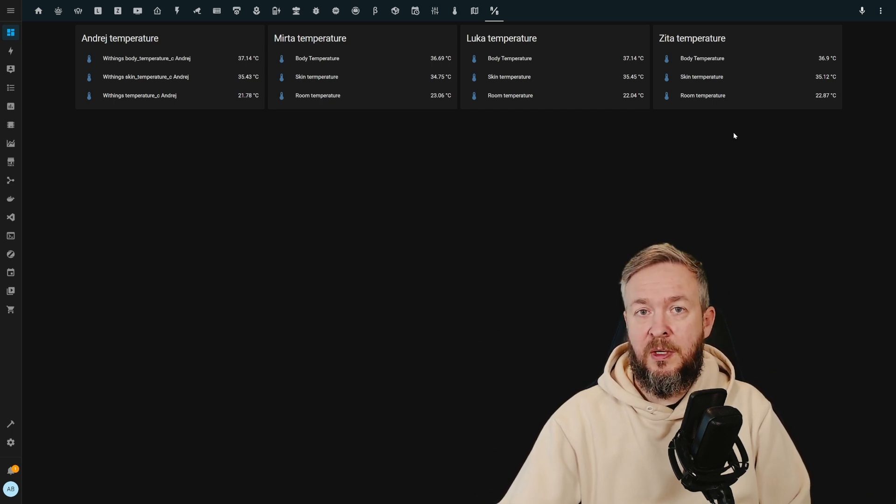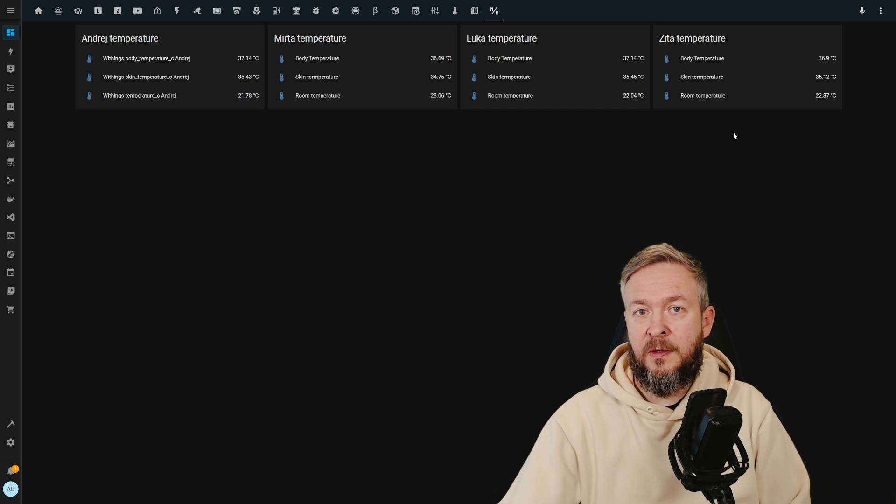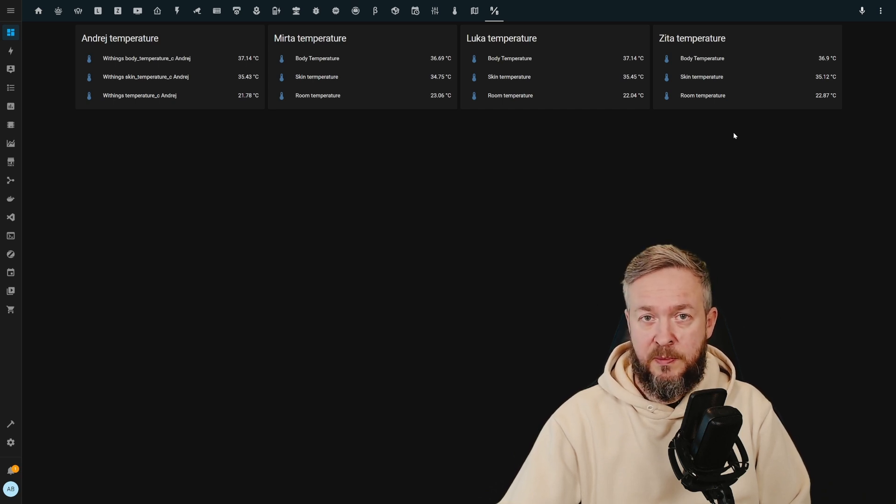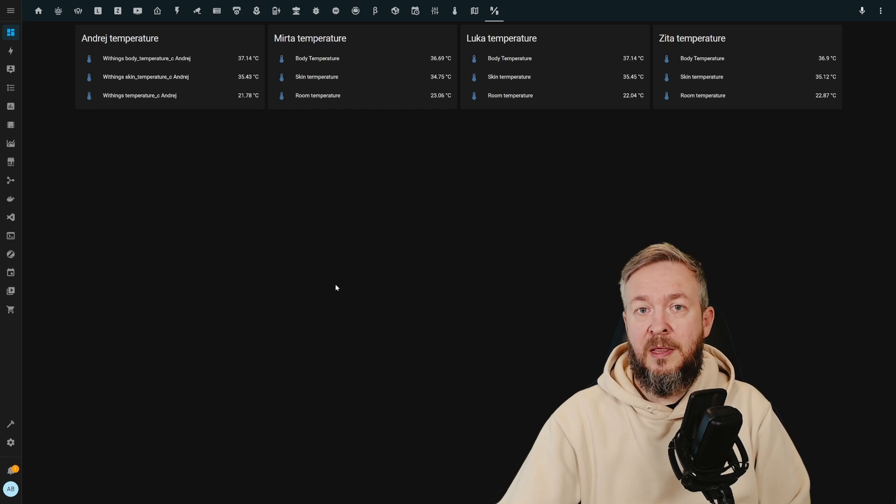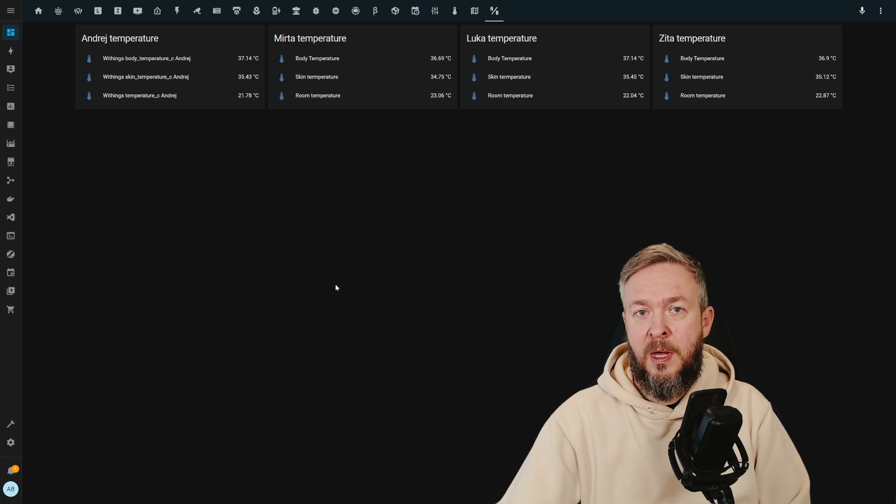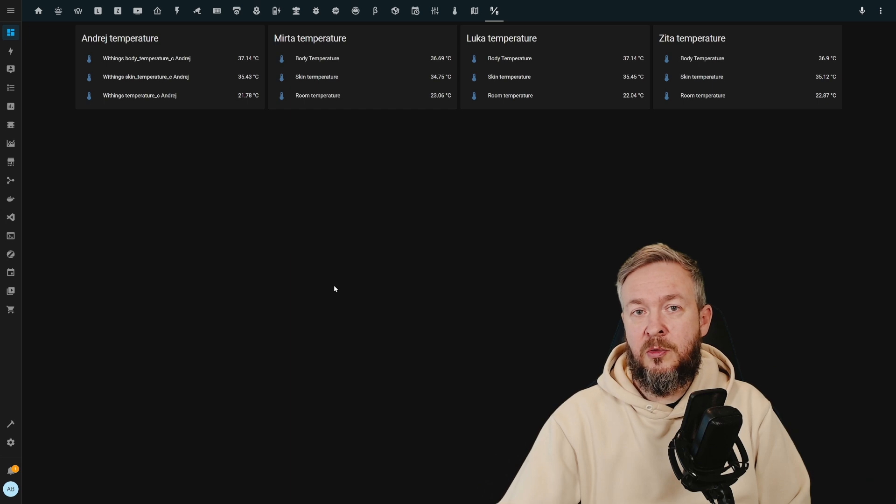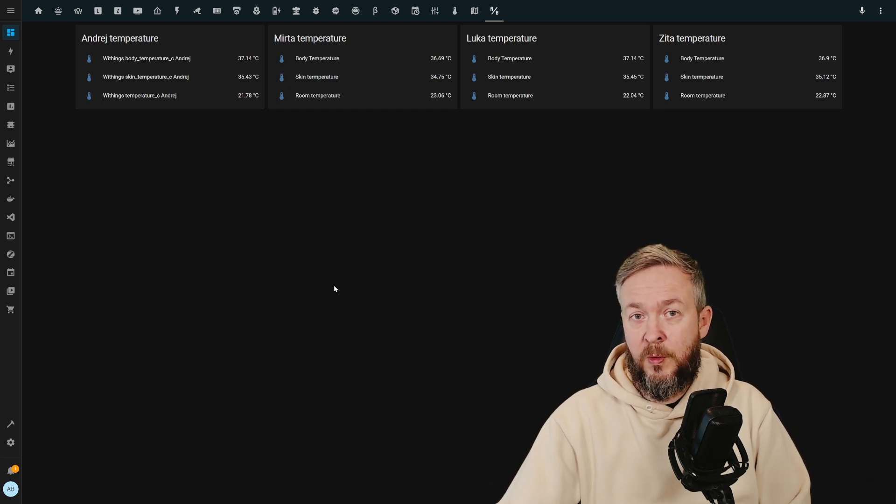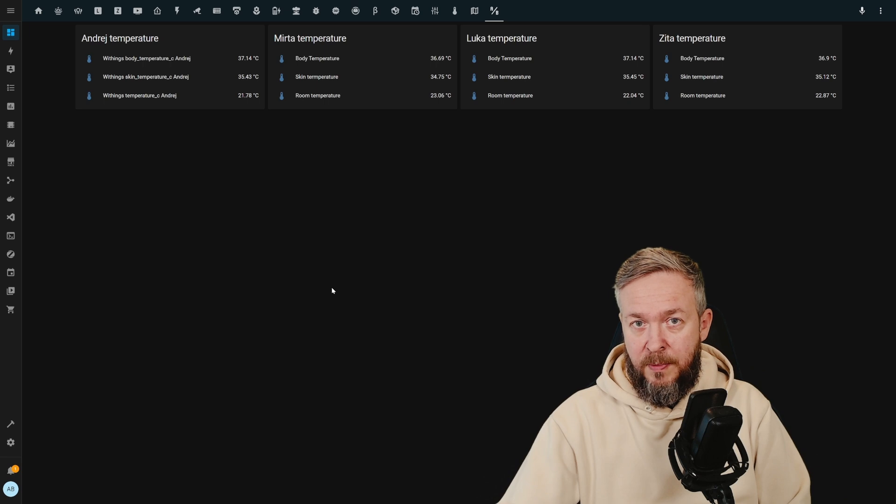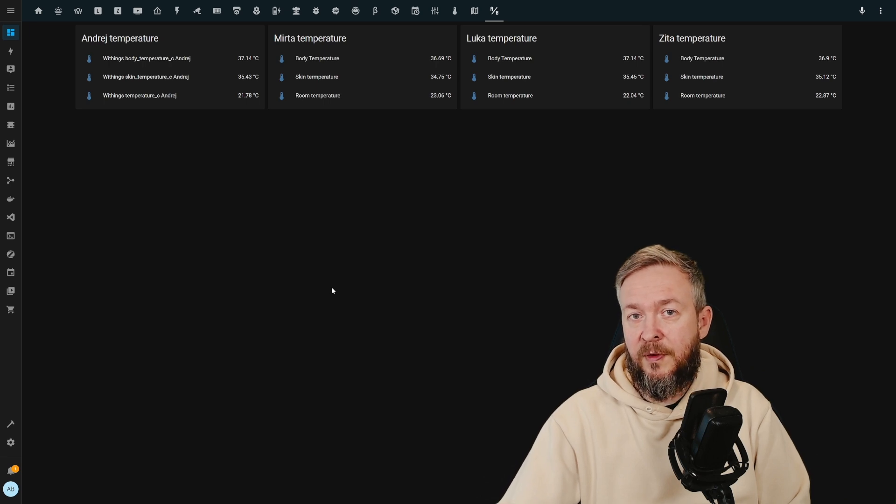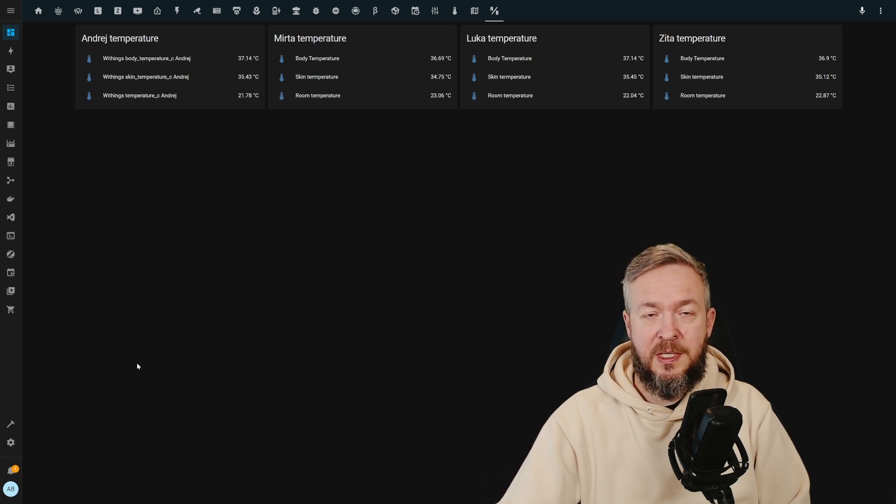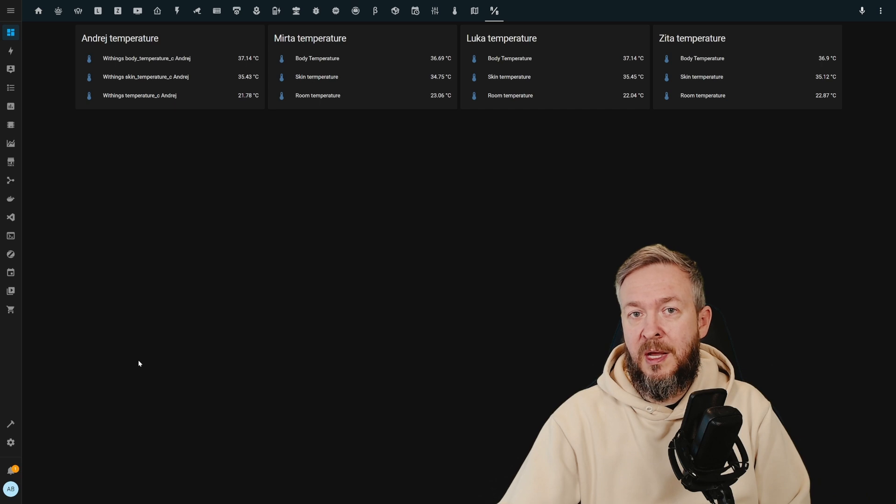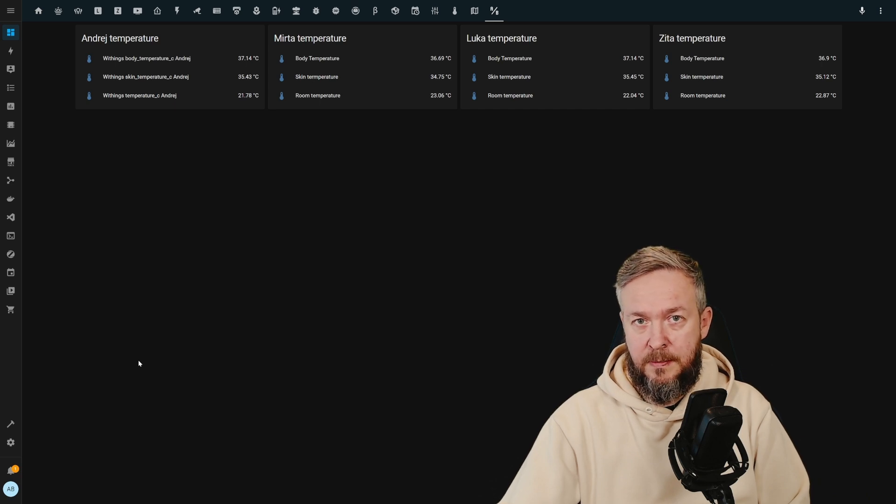You now should have all the data available from the Withings integration. As I mentioned in my setup video that I did last week, Withings integration does have one small bug. This bug is that from time to time, you may get notified that this integration needs to be reintegrated. But don't worry. Even if you skip that step and you still have that warning in Home Assistant, you may use it and the data will be synchronized.